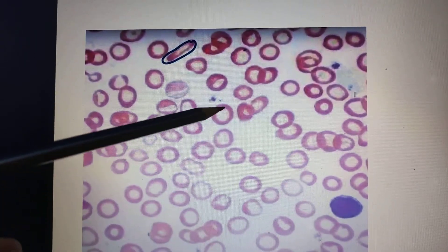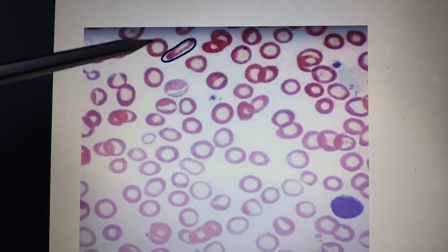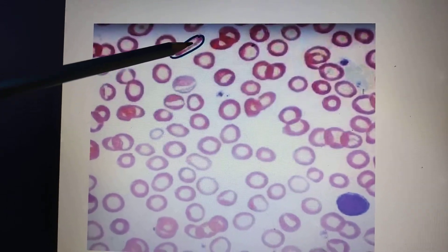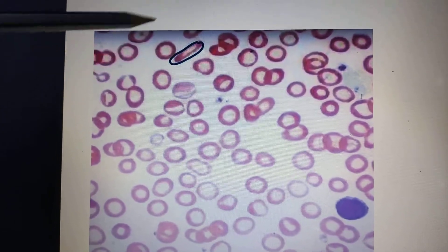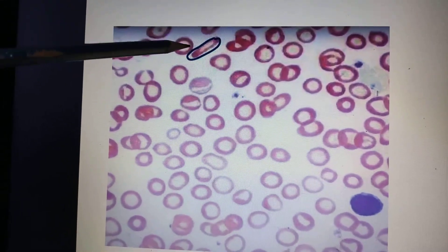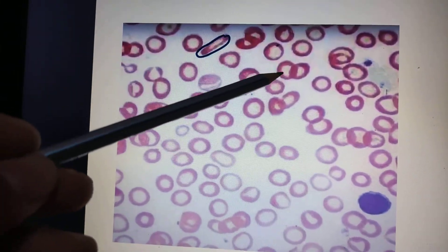So the size is reduced compared to the lymphocyte and the central clearing is increased. Along with this, if you look at the shape, you can see it is more of an oval or longitudinal shape — it's not circular.